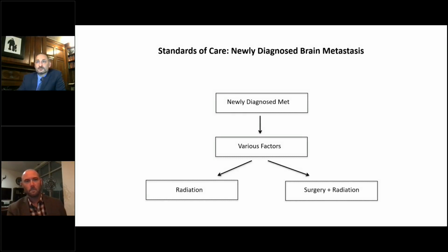Given glioma's infiltrating nature, what kind of contour or margin do you aim for in these lesions? And how often do you find these results in worsening deficit when near eloquent tissue? Yeah, so very good question. Along the same lines, if I have viable tumor on biopsy, if it's not, let's say, a radiation necrosis case, which we'll get into, I'm absolutely trying to take that blue line, which is the kill line, out to the margins of tumor, which means out through the contrast enhancing areas.